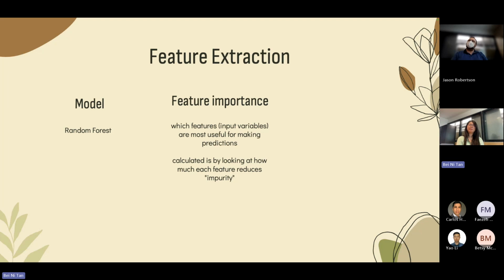Something they need to mention is why she's doing this, right? I think the important part of her project is that, if you remember, in one lab meeting she presented a paper that evaluated different ways to calculate connectivity matrices and which one could be best for fMRI data.